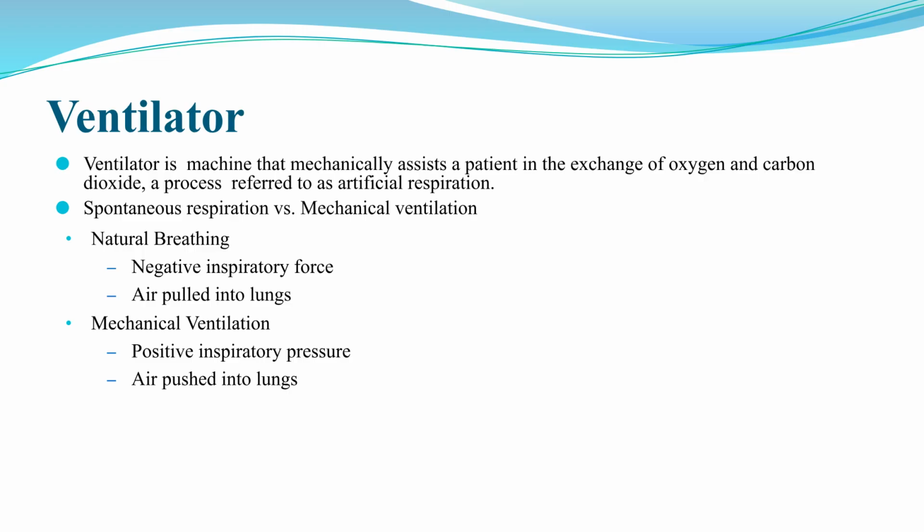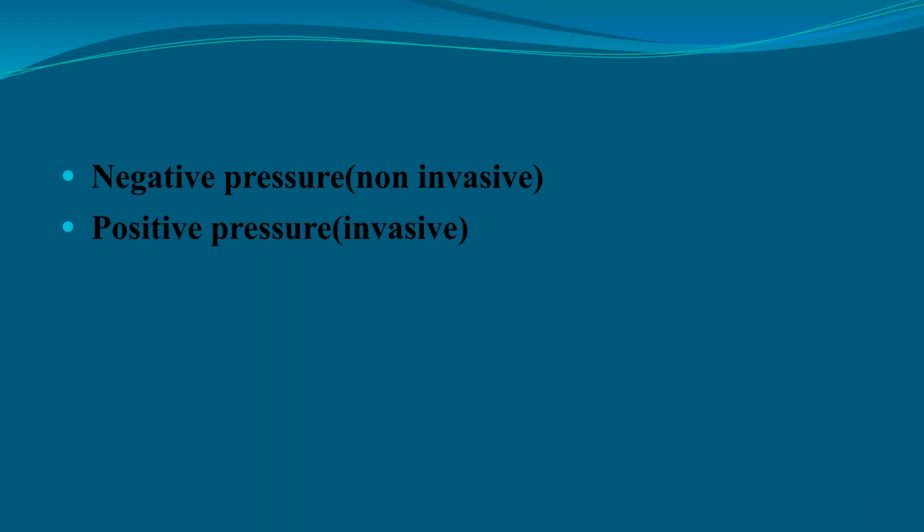Natural breathing involves negative inspiratory force, pulling air into the lungs. Mechanical ventilation uses positive inspiratory pressure, pushing air into the lungs. Mechanical ventilation can be categorized into negative pressure, which is non-invasive, and positive pressure, which is invasive.